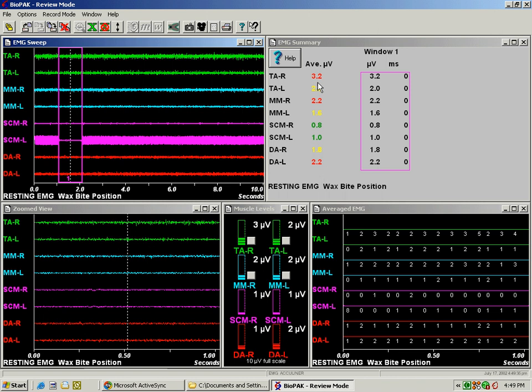In the numbers here we can see that the SCM right and left are recording at a normal level, 0.8 microvolts and 1 microvolts respectively. The temporalis left, masseter left, and digastric right are in an intermediate range between 1.5 and 2 microvolts.